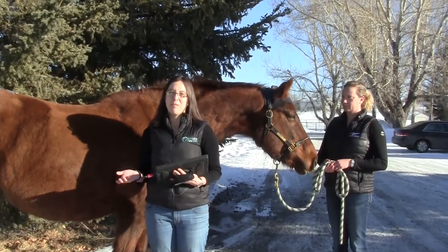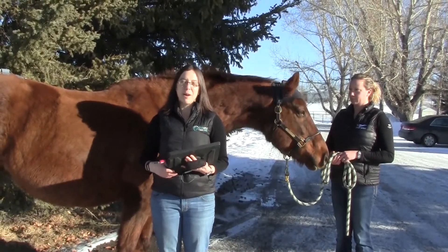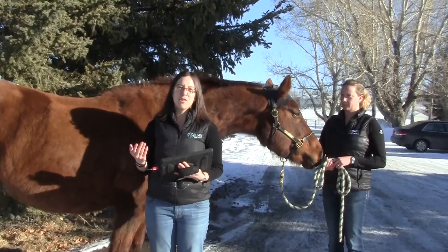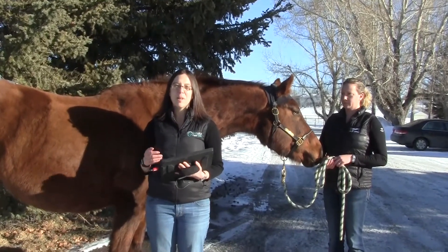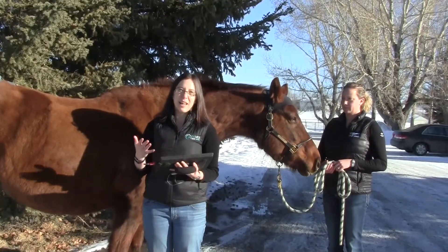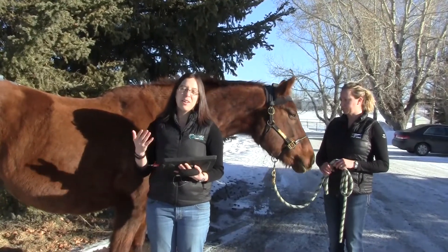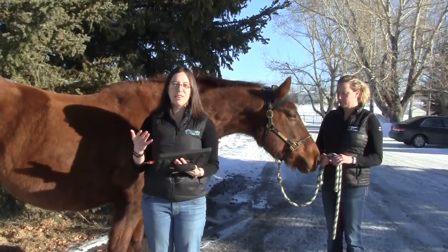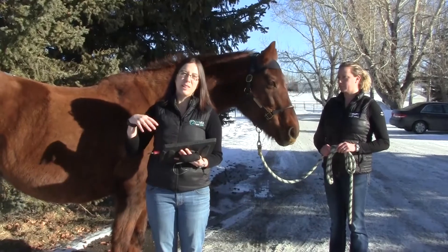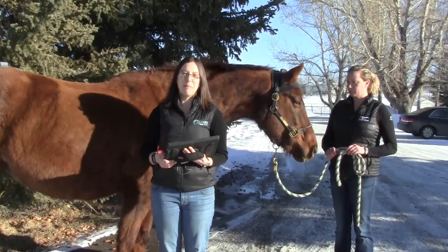When using the Lameness Locator as part of a lameness or pre-purchase exam, we trot the horse in a straight line up and down to get a sufficient number of strides for an appropriate reading. We can also use it during a circle evaluation at the lunge in both directions. The sensors transmit wirelessly to a tablet providing the graphs and numbers, and it identifies which phase of the stride the lameness comes from — whether impact as the foot is set down, or push-off as the horse pushes off to take another stride — which can give clues as to the source of the lameness.